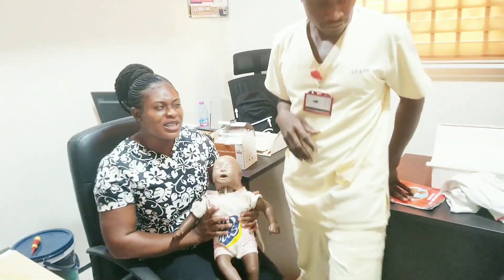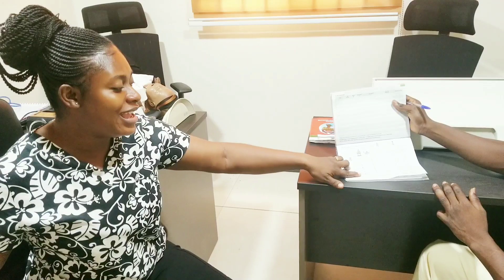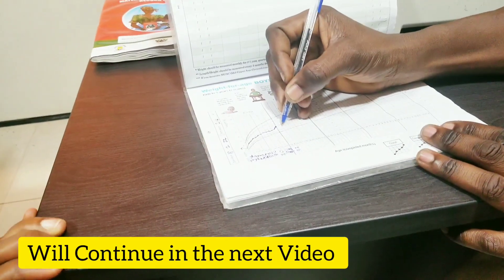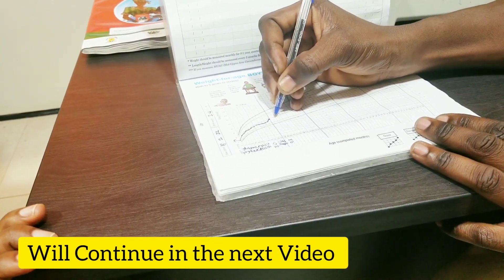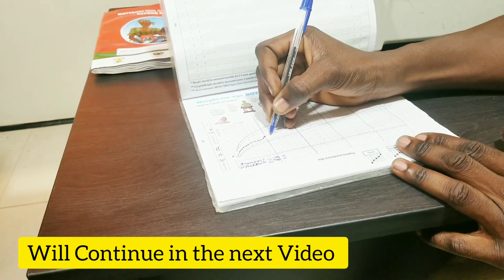After the weighing, our helper proceeds to chart the result. Somebody just came for weighing and the weight is 9.3 kilograms against 14 months of age. That is what our helper is charting now.